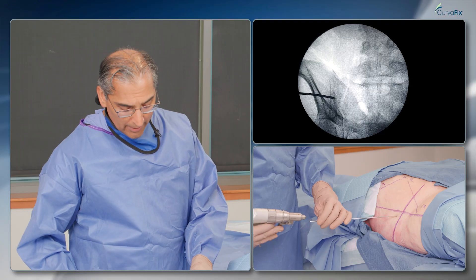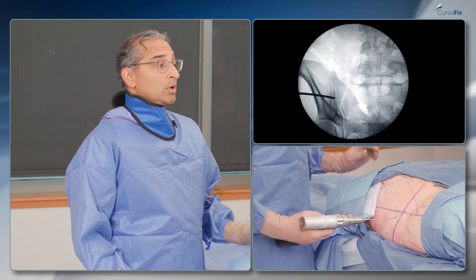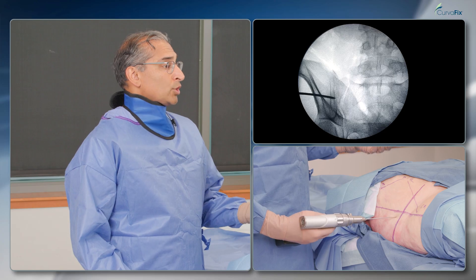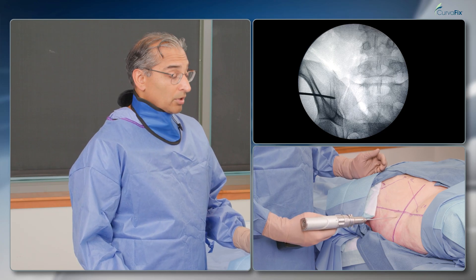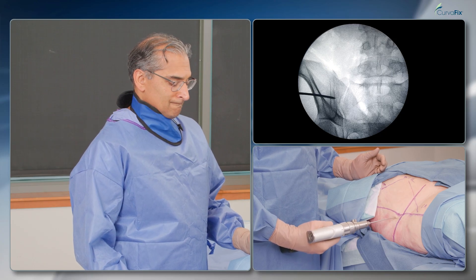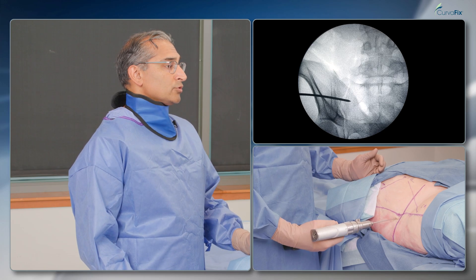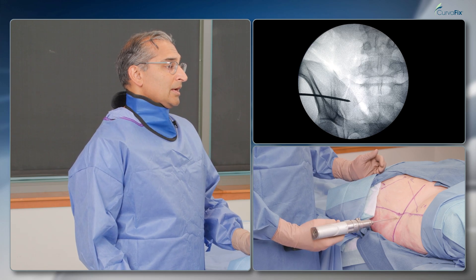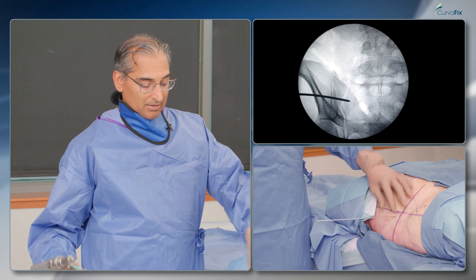It's a downtrending wire. Not ideal if I was doing a sacral transiliac screw utilizing traditional fixation, but with the CurvaFix, a downtrending wire is not a big deal because I can easily navigate around the tunnel. Good hard bone here, so it'll be a good use of our drill tip wire. That's heading right to the tunnel, and even with the CurvaFix, that makes me a little anxious, so I'm going to redirect that.